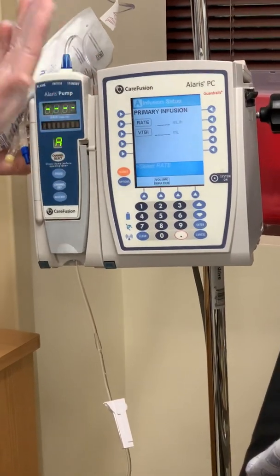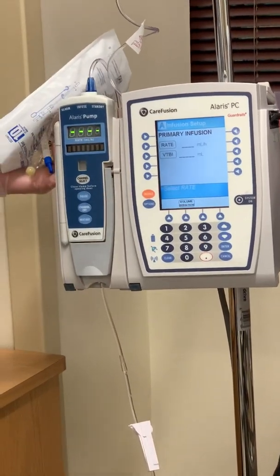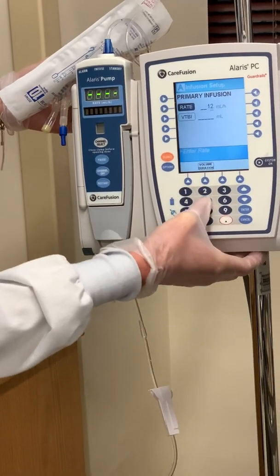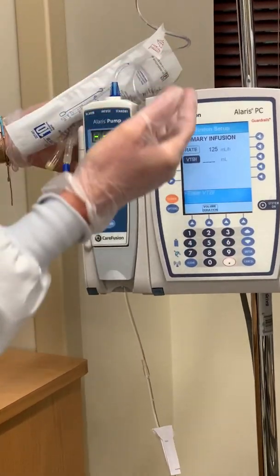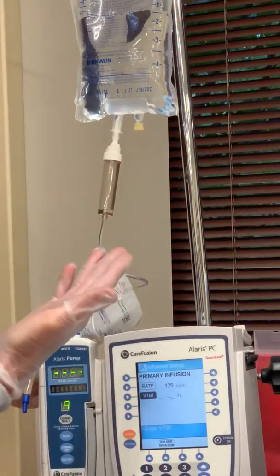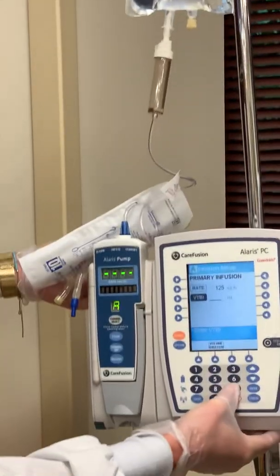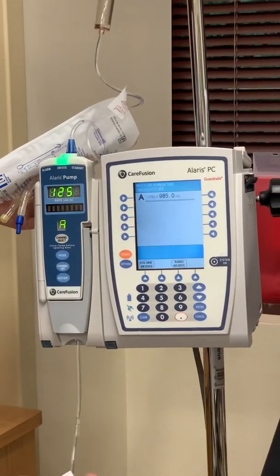We're going to say that the orders were for the patient to have LR going at 125. We're not giving a bolus. We're going to do it at 125. So I've got my rate right here. I'm going to go to rate, and I'm going to do 125. You see that? Volume to be infused. We're going to say that we've got a bag. I'm going to pretend that we have a 1,000 mL bag, which is the normal thing that you're going to see when we're hanging fluids. And I don't want to go all the way, right? I don't want to drain my line. So we'll say 985. That's my volume to be infused. So I'm going to go ahead and restart that because I realized that his fluids weren't going.